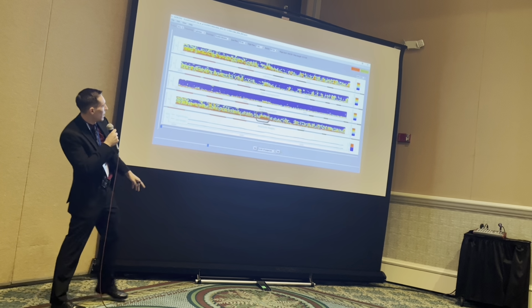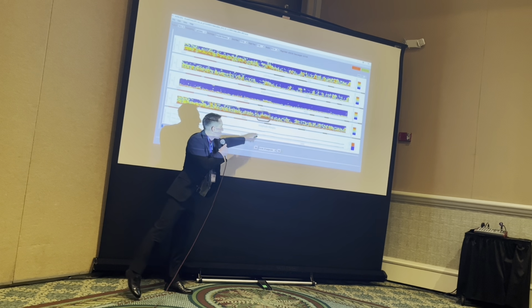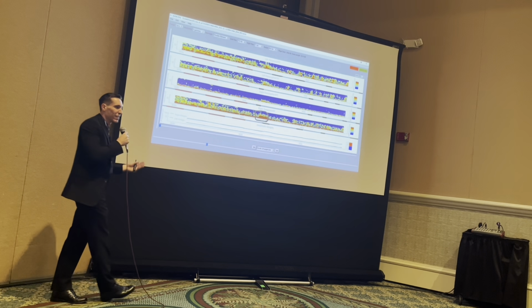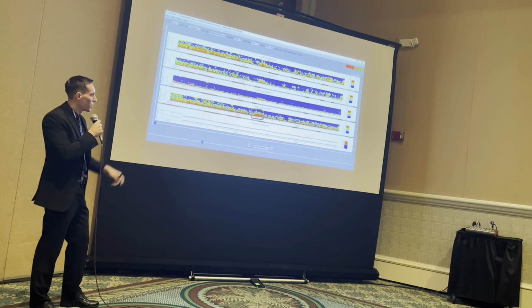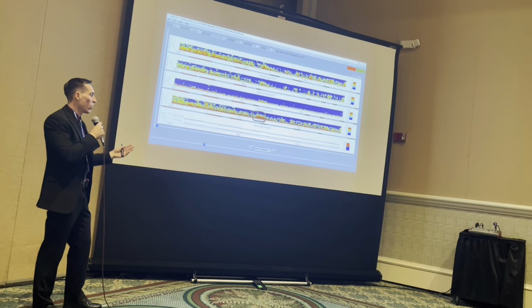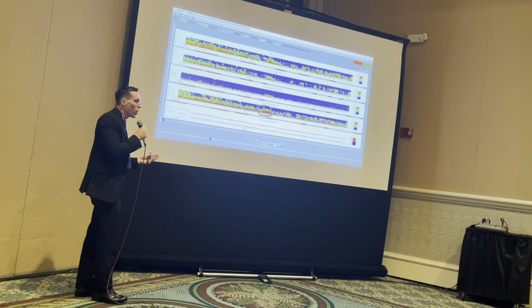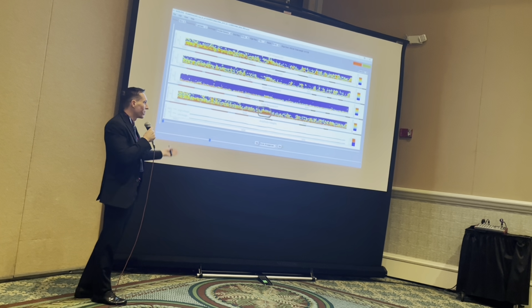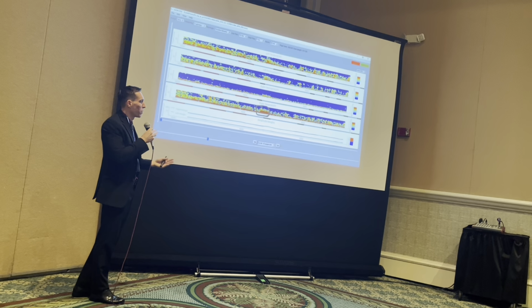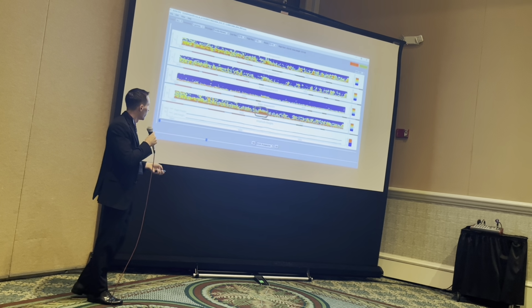If you check the average amplitude, it doesn't really rise like it did in the other more obvious examples. So this is a very subtle seizure, and you're always going to want to look at the raw EEG waveforms to confirm that this flame is in fact a seizure and not some type of artifact or something like that.